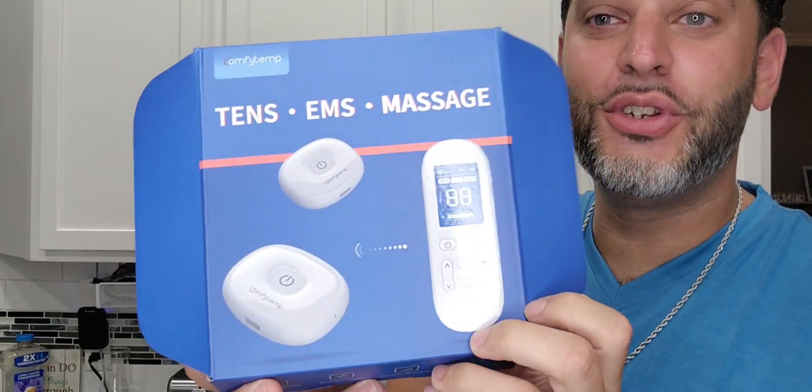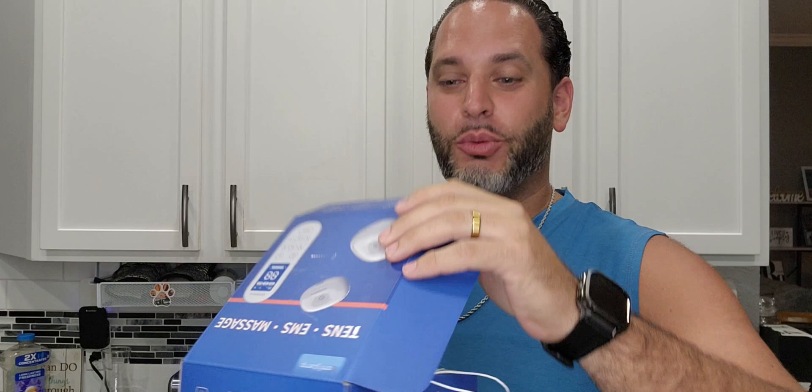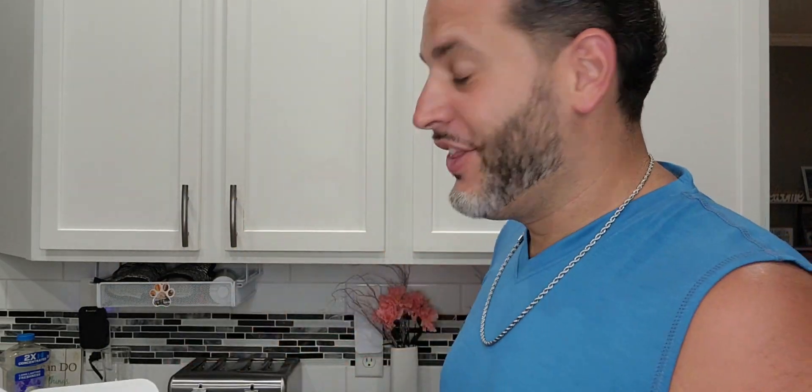I was gifted by the brand Comfy Temp this TENS unit right here. What makes this one a little bit different — I've had a couple different units in the past — is that this one is actually wireless, which is awesome. You don't have to worry about wires going all over the place.